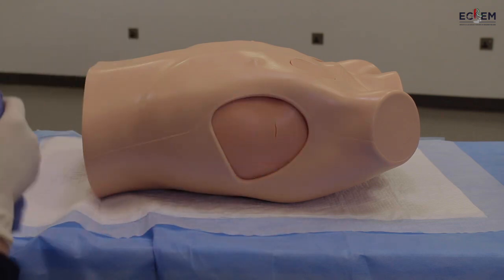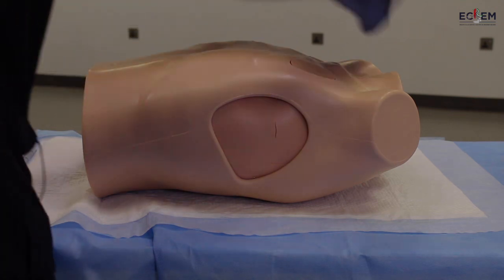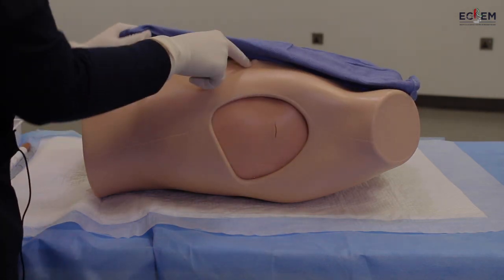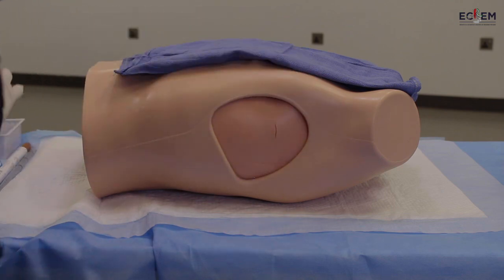Now I'll start draping whatever area is not needed. I have to keep the nipple visible so I know where I'm going.